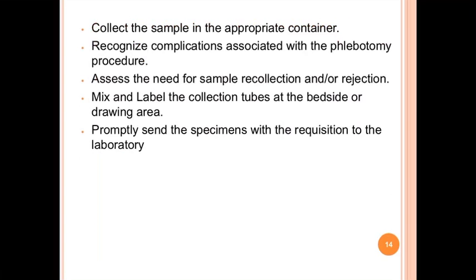Collect the sample in the appropriate container. Recognize the complications associated with the phlebotomy procedure. Then assess the need for recollection of the sample or rejection. Mix and label the collected tubes at the bedside or drawing area. Promptly send the specimen with the requisition to the laboratory.